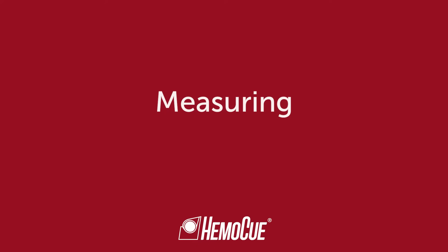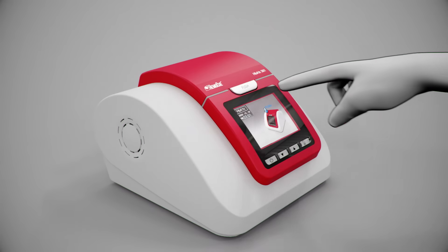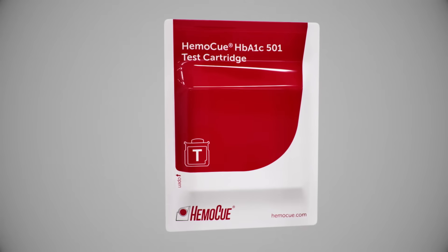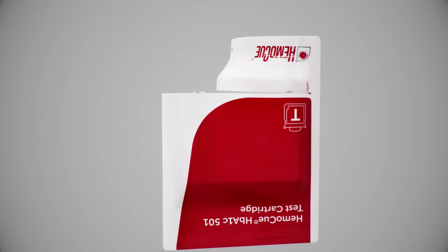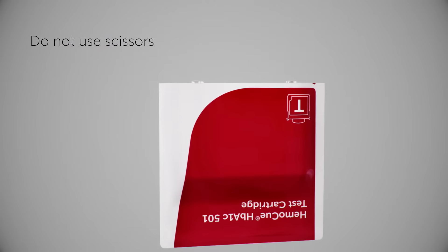Welcome to the HemoQ HB A1C 501 system instructions on capillary sampling and measuring. Open the lid. Open the test cartridge package by tearing the pouch on the side with the serrated edge. Do not use scissors to open the pouch.